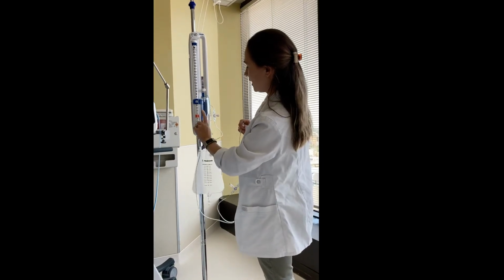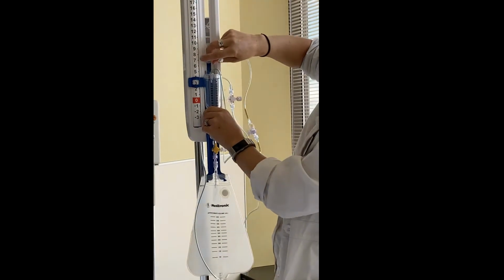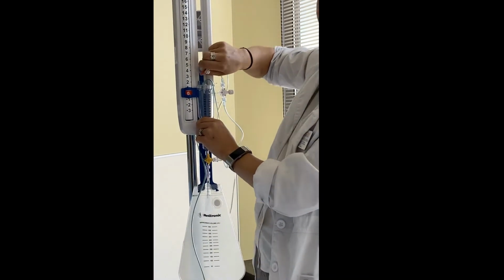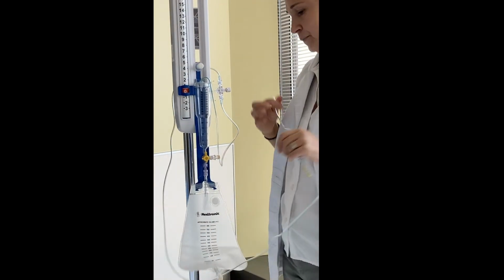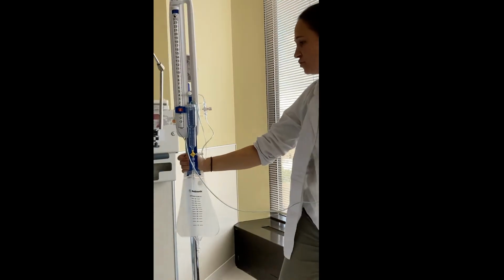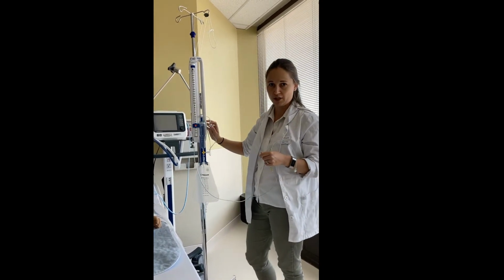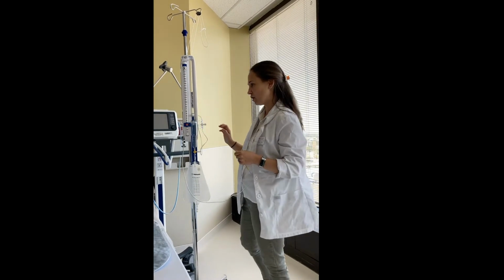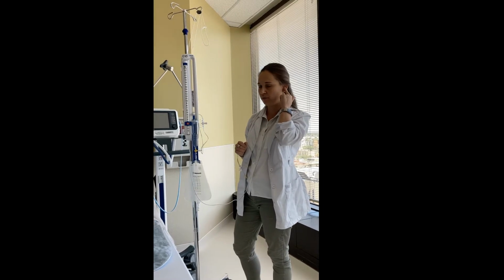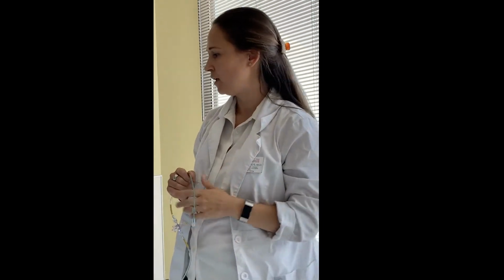Okay, this is an absolute 0, so when it's here, you're not likely to see any drainage, because this is also the atmospheric pressure. Now, the other thing that you need to do with the system is you need to level it to the patient. And normally we try to level it to the third ventricle, which is approximately at the tragus of the ear, so the external auditory meatus, and the tragus is this little piece on the ear.